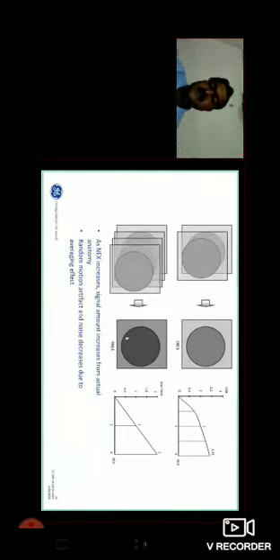Okay, so another factor: the SNR also depends on which coil we are using, and how we are positioning the coil. For example, if you are imaging the spine, we use only the posterior array coil.